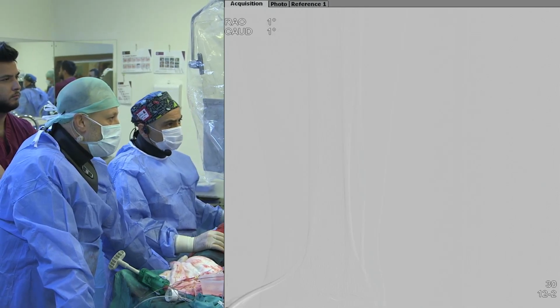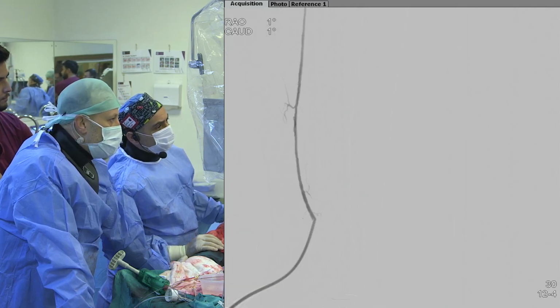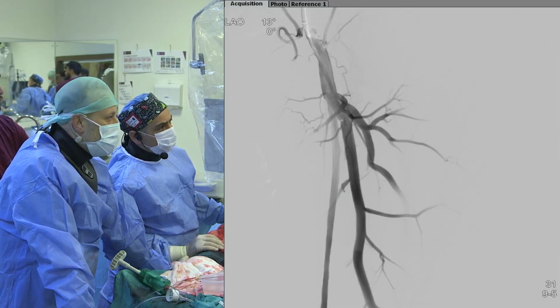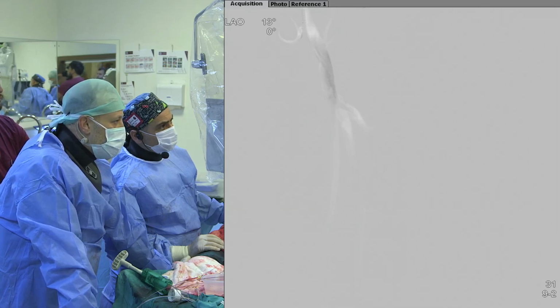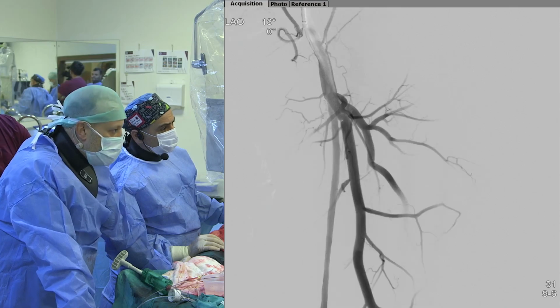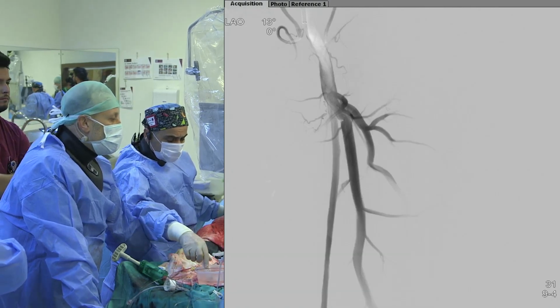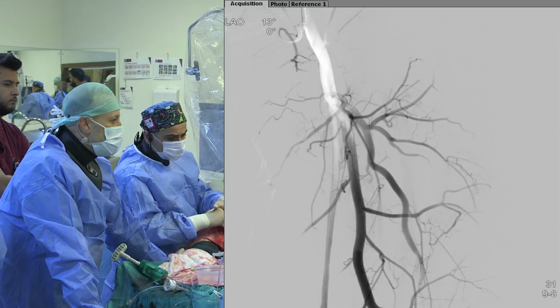This we look for the posterior tibial artery. If there's a problem with that, there isn't any problem. The next one, please. And this is the last image after the drug-coated balloon. Do you have any recommendations? Congratulations, Ersan. The result is acceptable.